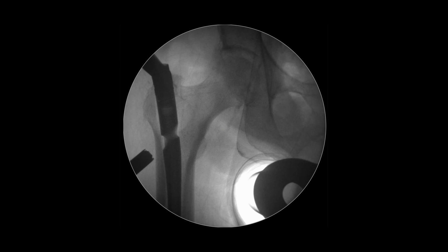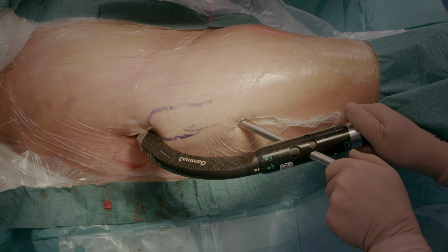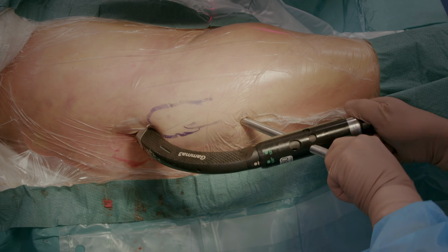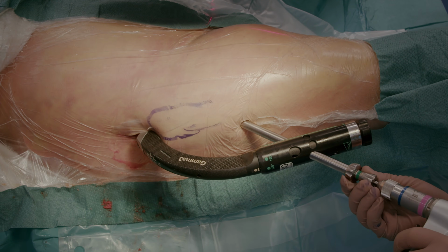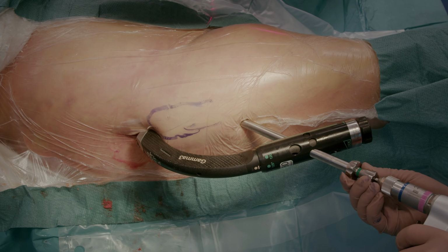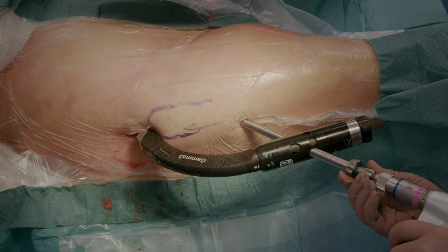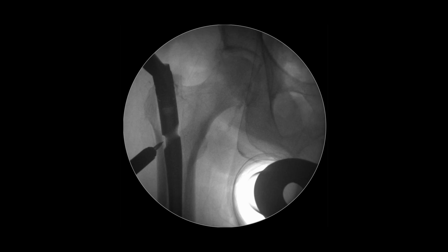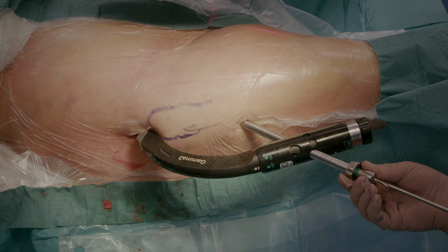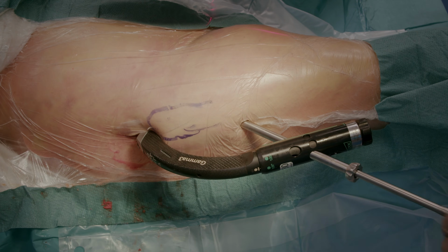Check from the image that the guide sleeve is properly against the lateral cortex of the femoral bone. Then, the lateral cortex is first opened by drilling. We then change the trocar to match with the guide wire gauge.